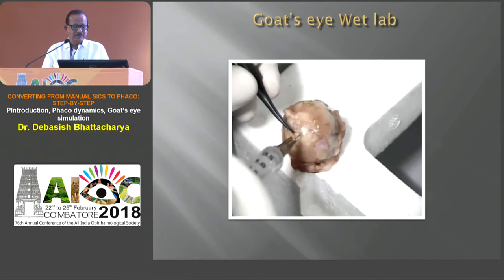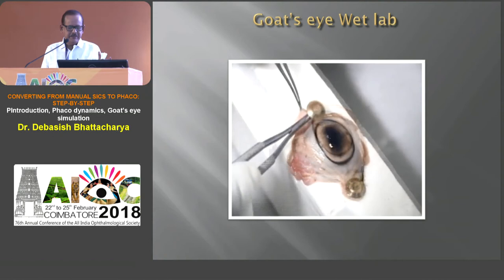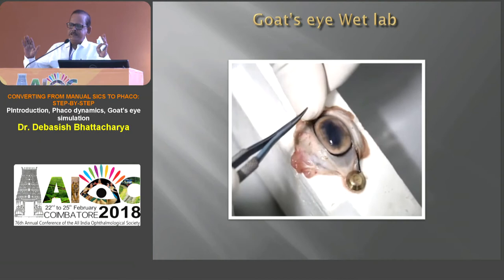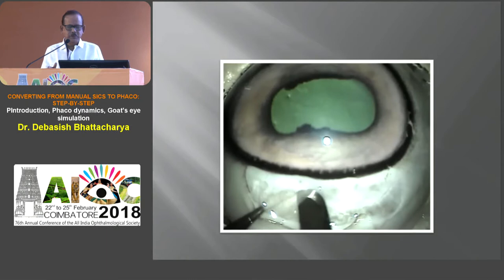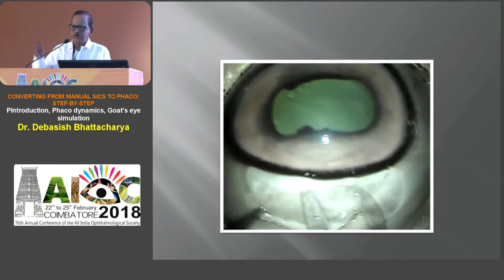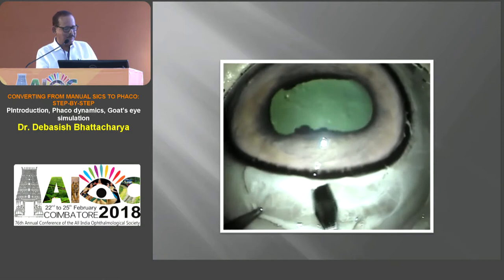Wet labs are extremely important. The goat's eye is freely available in the market — take a thermocool box, fix it — this is the biggest, easiest simulation you can have in our Indian context. Here we are doing a scleral tunnel and the sclerocorneal valve, in the style of our SICS, which is a popular brand of cataract surgery here. You can practice rexis — far better than practicing over a boiled potato or cigarette wrapper — this gives you the best feel.